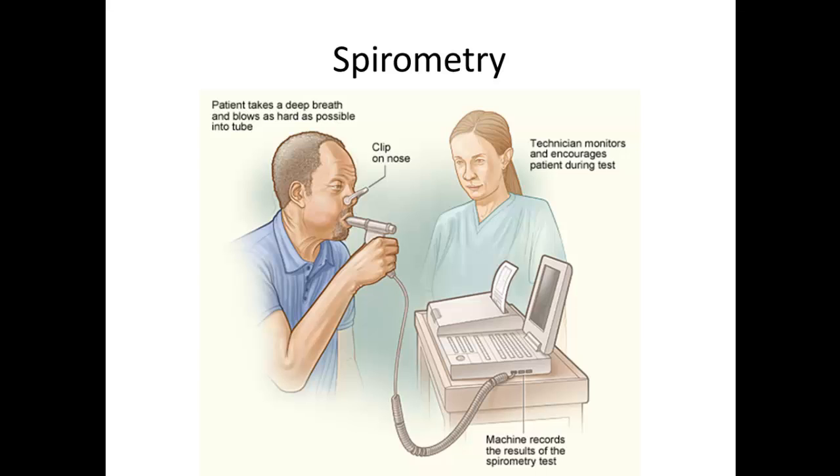So here is a picture of a spirometer, an older version of a spirometer, which is measuring a patient's breath as he's breathing out into the machine. Now this is very important because certain conditions can cause problems with the lungs, and hospitals and doctors want to know if there is progress when a patient is going through a disease and if they're able to breathe better, how much their lung capacity changes over time when they're getting treatment for a certain lung condition.